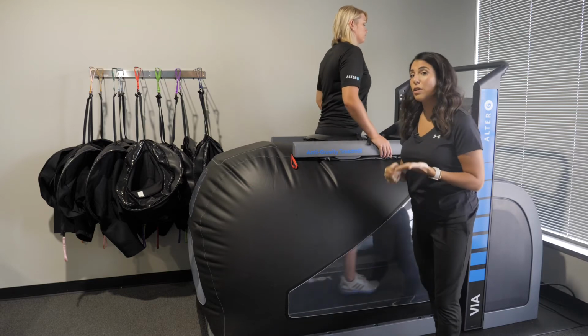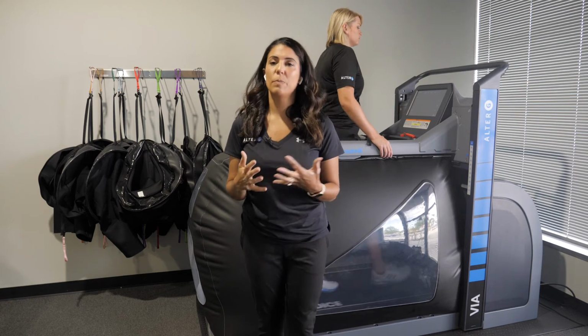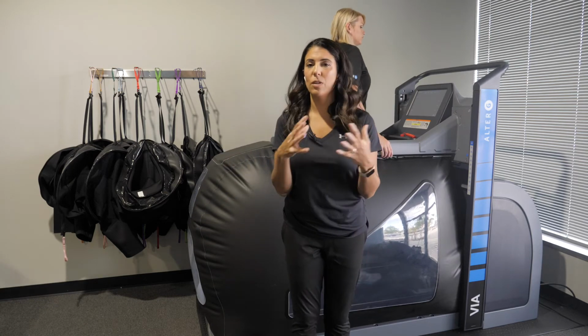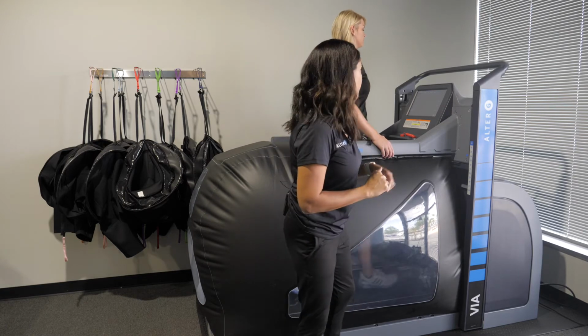Some of our machines also have the capability to go in reverse and incline. So it really depends on which model you're purchasing and which features you feel you would benefit from in treating your patients.